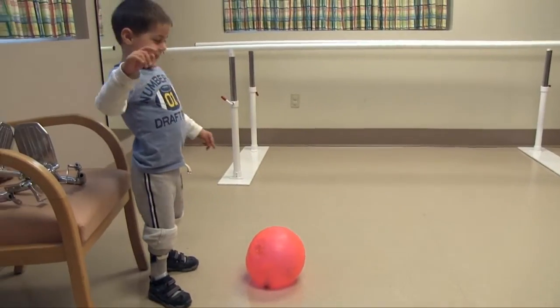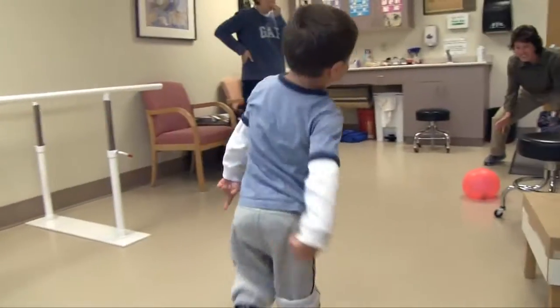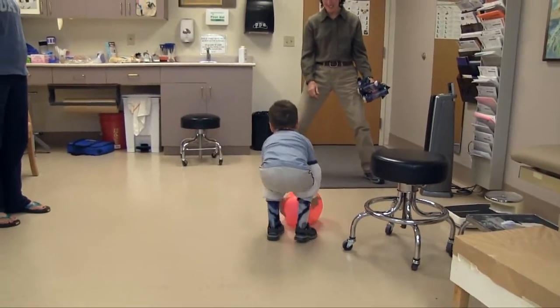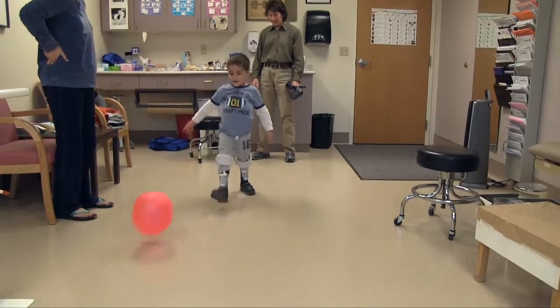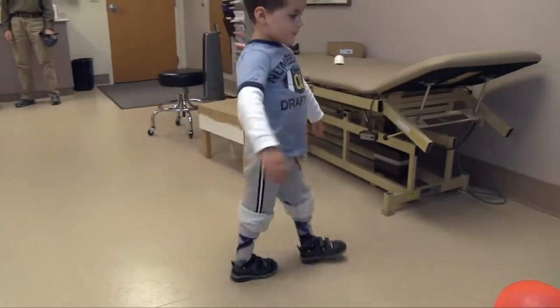Here he is walking with the new braces on. He's much happier with this position and he's comfortable. With the shoes and the braces he's now at approximately a 3 degree angle. This is more similar to what he's had in the past.